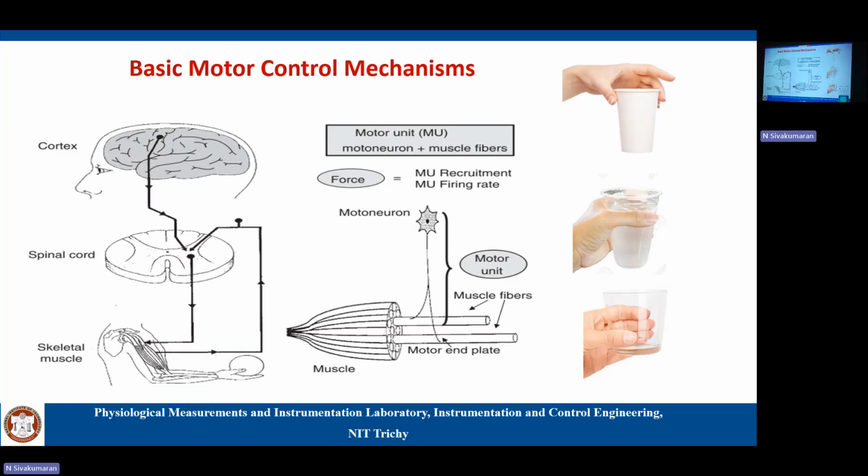In rehabilitation, for example gripping activity, pinch grip or power grip, that is generally missing. For example, if somebody has a wrist disarticulation, they don't have the hand, so this feature will be missing. Engineers generally work to restore those movements with EMG, because muscle generates force to lift this object.